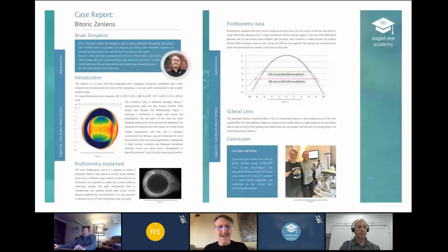So that's kind of my resume on the case and how we are really, really thankful for the team for helping us out on this guy. And more importantly, Sean is really helpful. He was 14 when we first saw him. He's now a qualified teacher wearing the lenses on a regular day-to-day basis and managing life. So yeah, thank you from us and thank you from Sean.